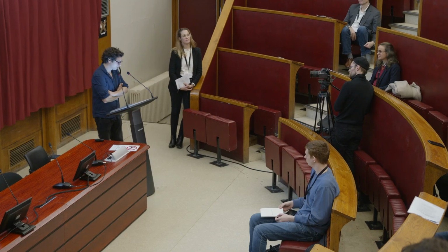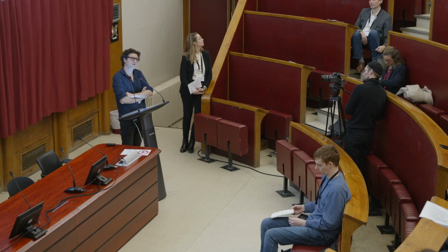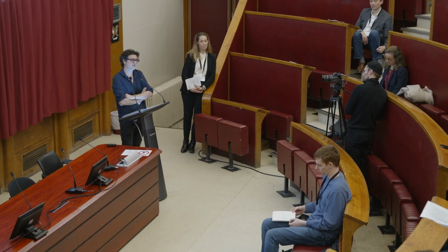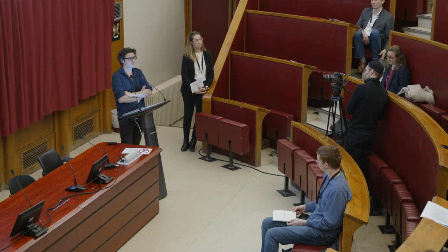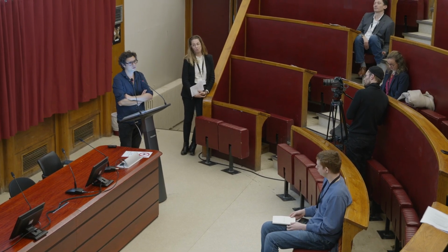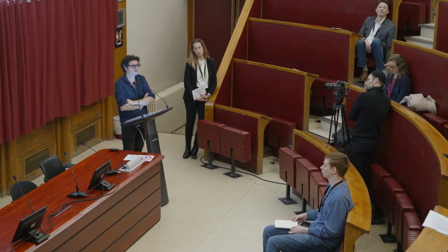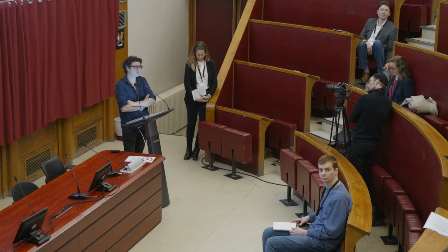And for the second question, sorry, what was it again? Applying the algorithm to low quality images. Yes, thank you. Looking back, I think this was a mistake. The problem we have in this data set is lack of diversity. We want more diversity in the images when training such models, because otherwise there is overfitting and it doesn't work well when the images you try in the second step are of low quality.